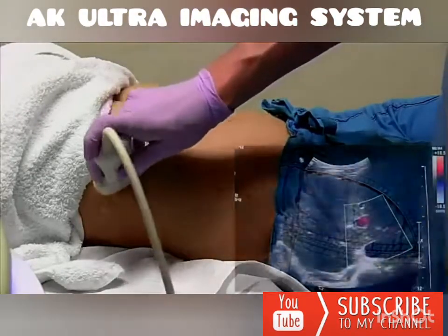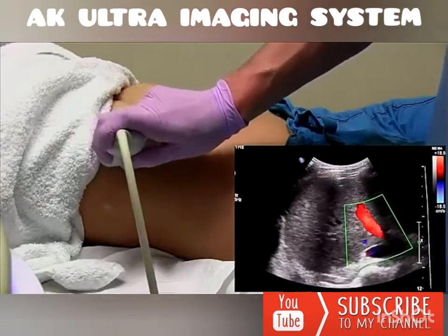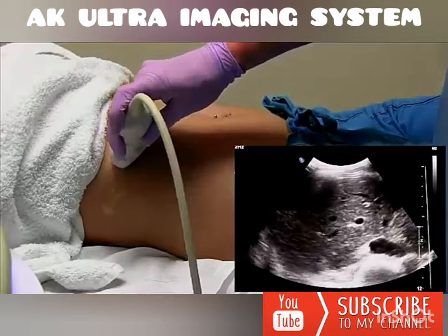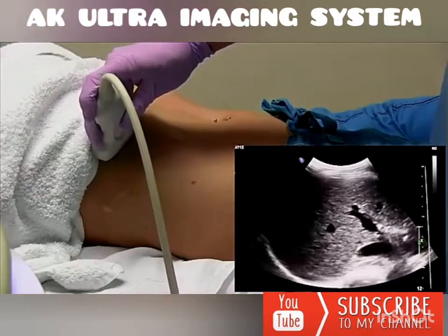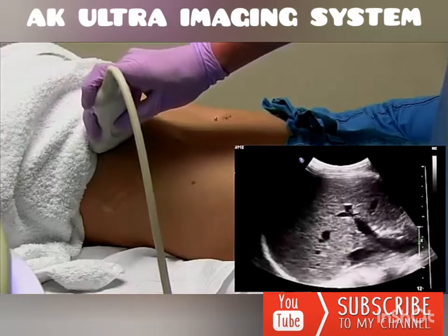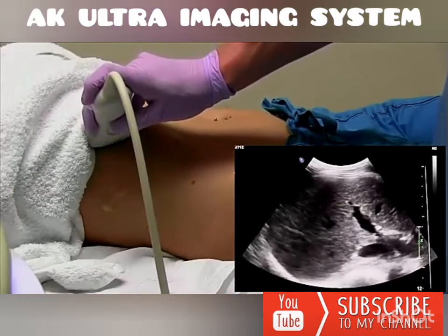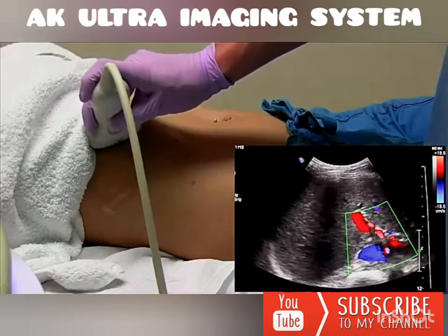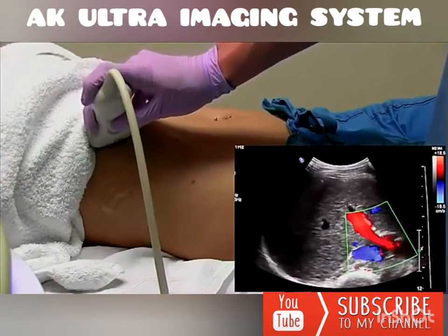So once you find the portal, you can just keep tweaking the probe until you elongate the CBD completely. And if you're not sure whether or not you're on the CBD or the hepatic artery, just put the color on. Whichever one does not fill with color is the CBD.